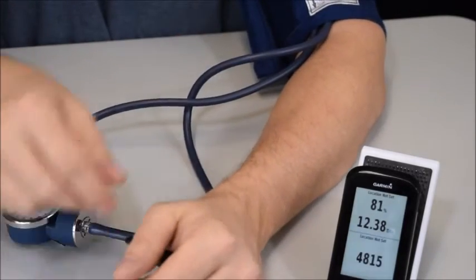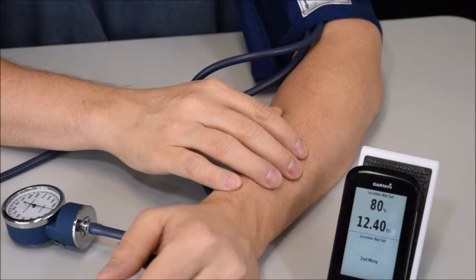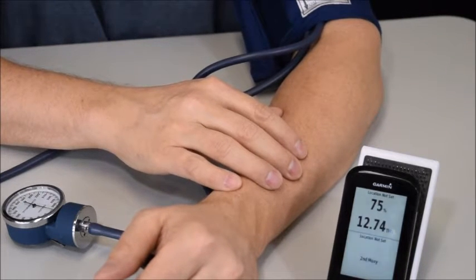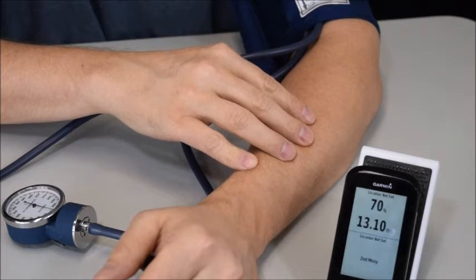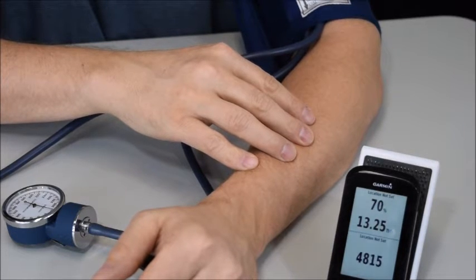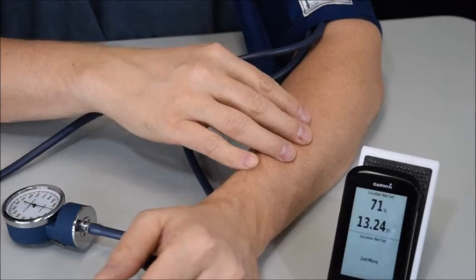And then we'll also do a measurement on the thenar eminence with the Moxie. It's common for the thenar eminence to measure a little bit lower than the forearm. And we're seeing this here measuring in the upper 60s or so. Maybe right around 70. Okay, so this is just the at-rest measurement.